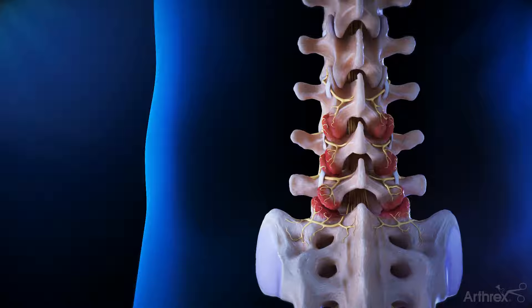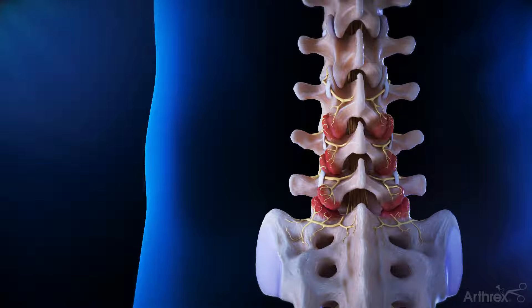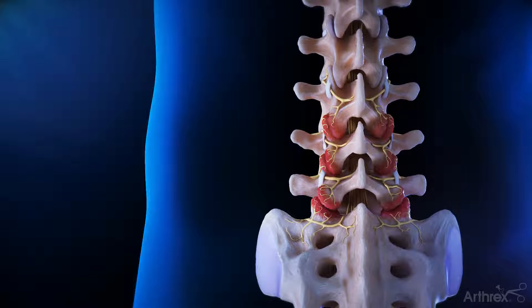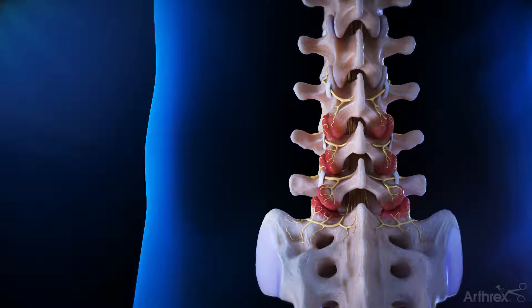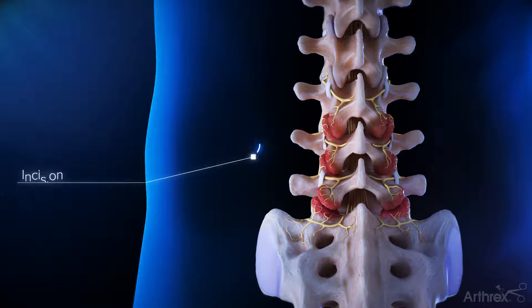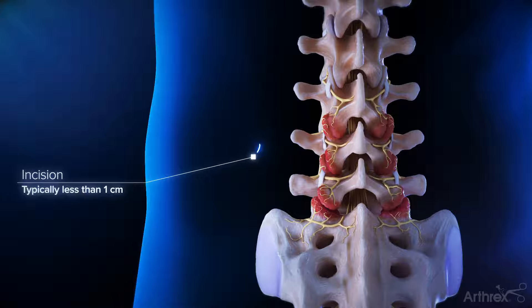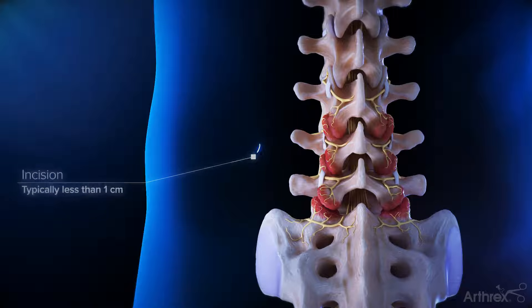Their goal is to address the pain caused by the arthritic facet joint by cutting the pain receptor pathway to your brain. The approach is done by creating a small incision, typically less than one centimeter, in a manner that minimizes soft tissue and muscle disruption.